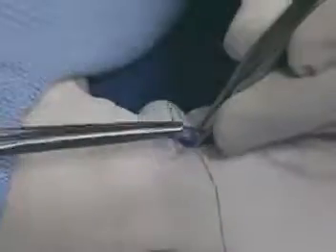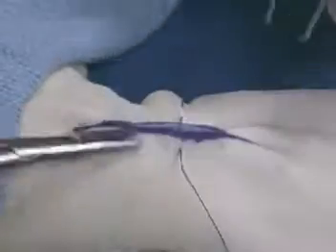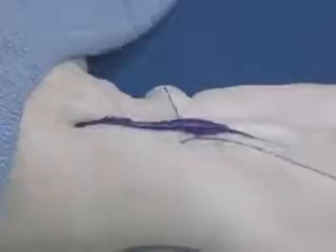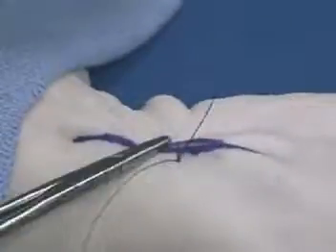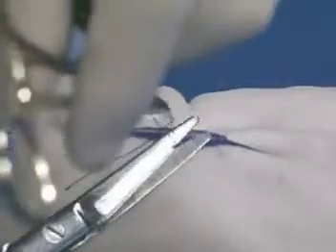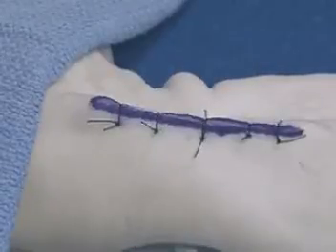Skin sutures are then placed according to the principles of halving. The first or central suture is placed midway between the long axis of the wound. Note that the edges of the wound are both approximated and everted. The skin suture is cut with a tail. The remainder of the skin sutures are also placed according to the principles of halving.